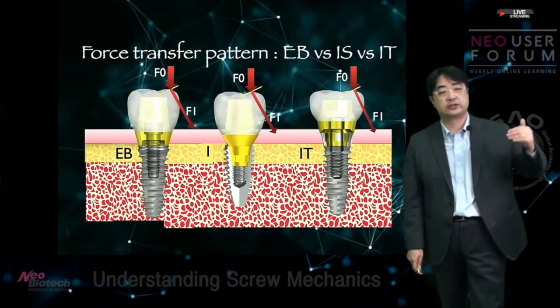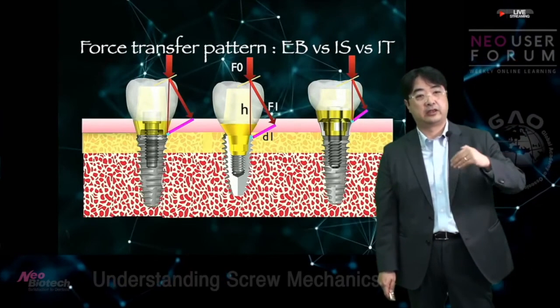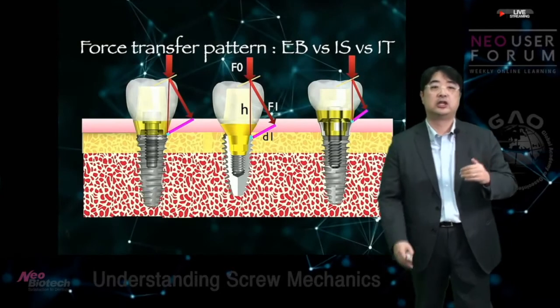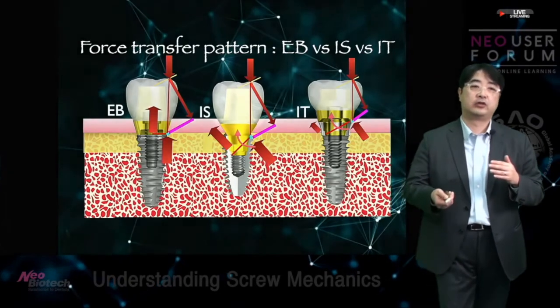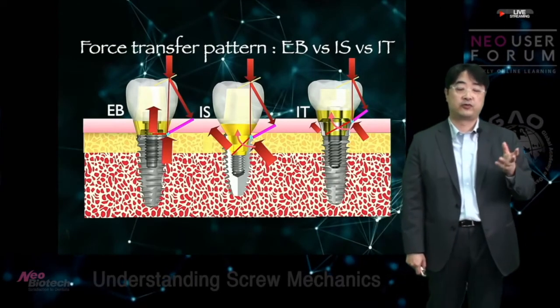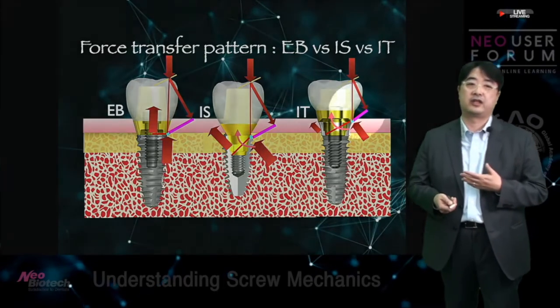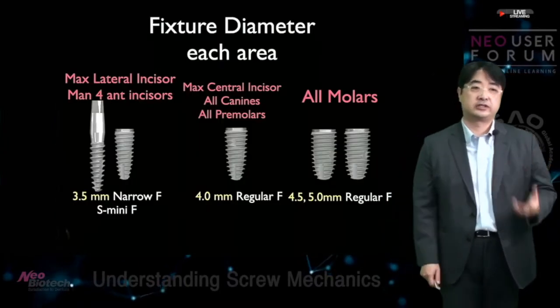Okay, if force is applied to the occlusion, like a crown of the dental implant, as you see, force is transmitted, right, rectangular to the bone and to the implant. So the distance from here to here, if you compare, this submerged type has a much longer distance because it is placed deeper, right? So the force and rotation center will be on top on the ITI type, which is favorable for force transmission, right? So if you think about placing a single implant on the lower posterior, maybe you need to think about choosing this type of implant better than this, right? And this is our suggestion as well.